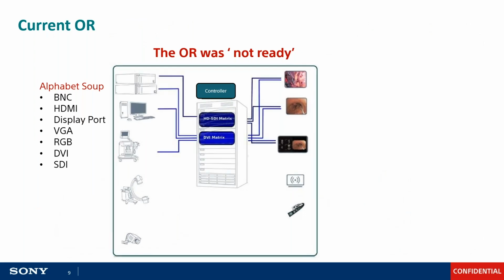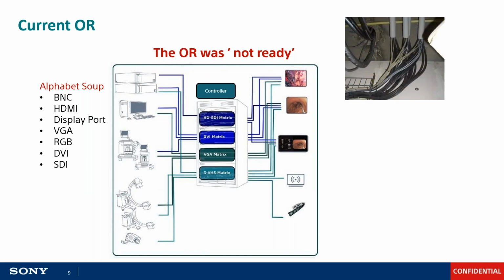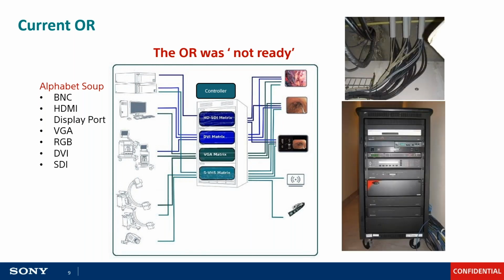So this is where we are today in many hospitals. Typically, you have a video matrix switch somewhere on the network, either in the room or right outside the room in the sterile core. And the nurses are always searching for a specific wall jack to plug something in. And we call it the alphabet soup, right? So you have many different physical connectors here. The other downside of this is that Biomed has to stock a number of different connectors, right? We all know that these cables are running over the floor, they get run over, they get broken, and they have to be replaced. So Biomed has to have a ready stock of this type of cabling.